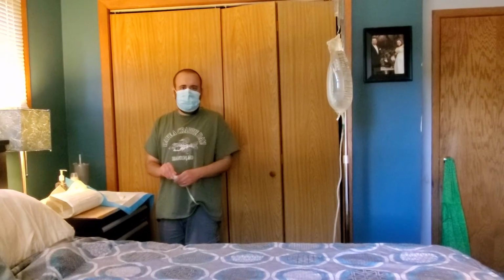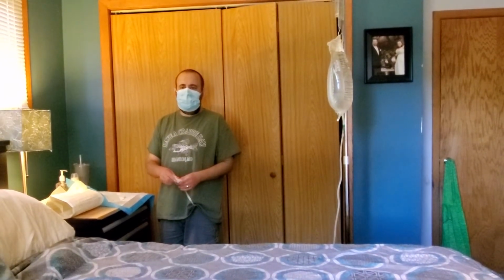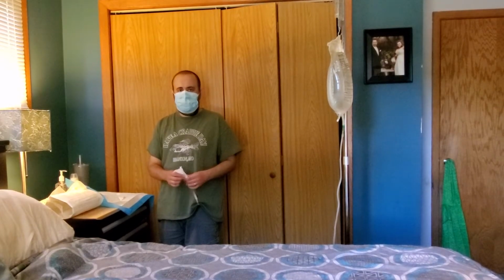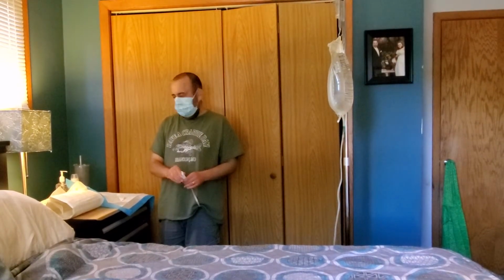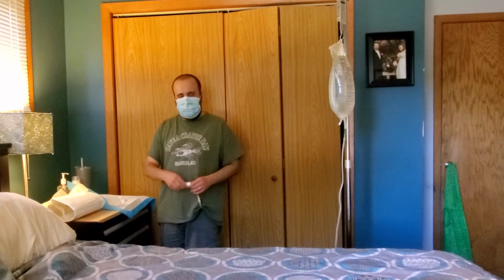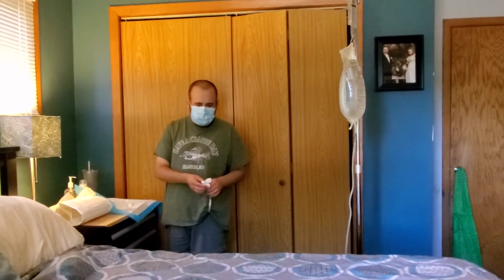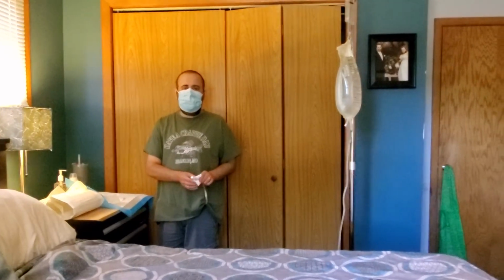The other thing during this time, once the catheter is being opened, there can be no pets or kids in the room, no fans on, and anyone in the room needs to be wearing a mask, because anything that goes into that tube will go directly into his body. This catheter goes in my abdomen and down towards my pelvis.